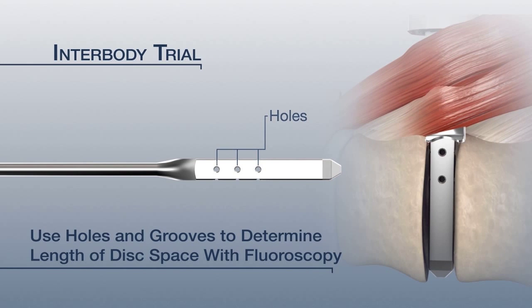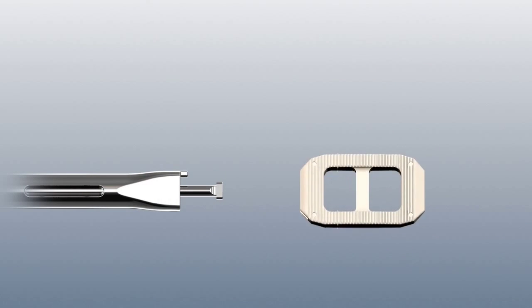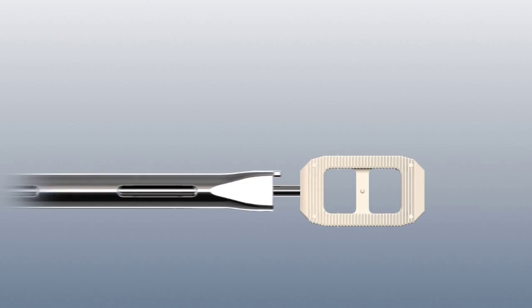Insert the trial and gently advance it until the distal tip reaches the vertebral body's contralateral side. Confirm placement and remove the trial. Select the desired interbody and attach it to the cage inserter by aligning the prong of the inserter with the cage and inserting the bowtie tip. On the inserter, rotate the sleeve 90 degrees and the knob clockwise to secure.